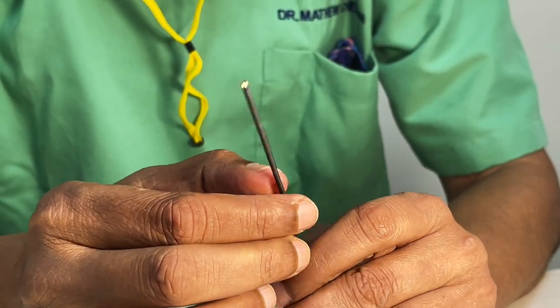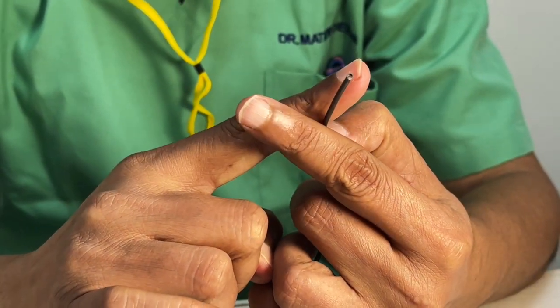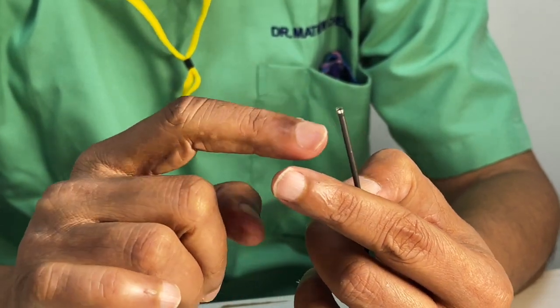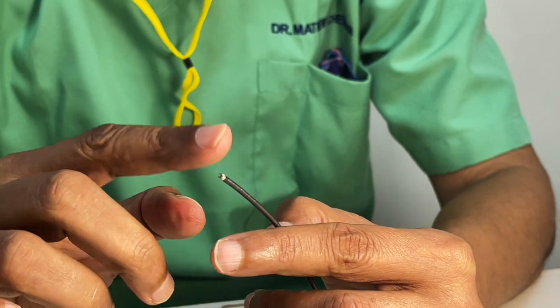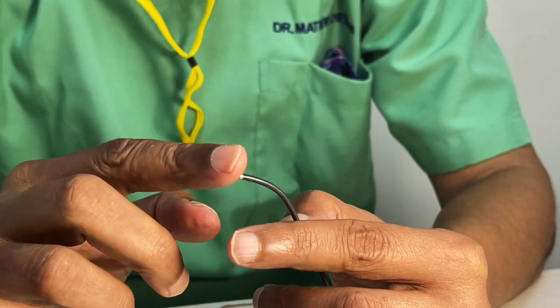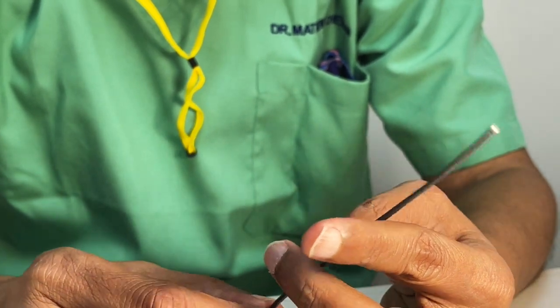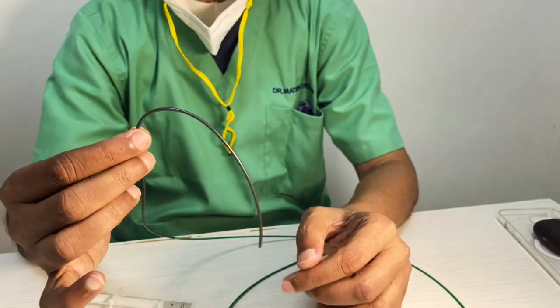Now, what have you achieved? When you give a braiding which is like an X, you're going to make it very pushable. When you make a braiding which is like a helical, you can actually make it very flexible. So by reducing the thickness of the material and being able to build a compound braiding, they made this an extremely good catheter.